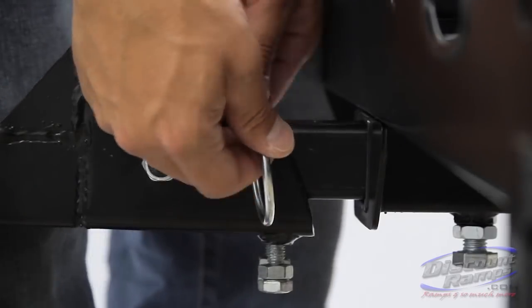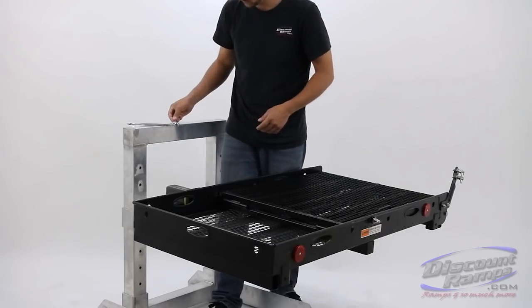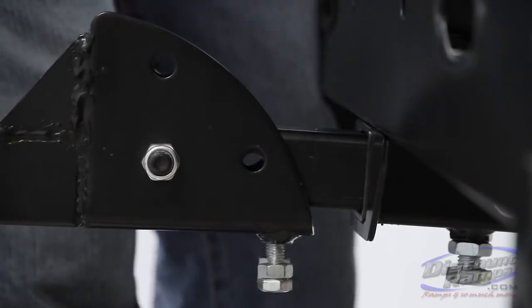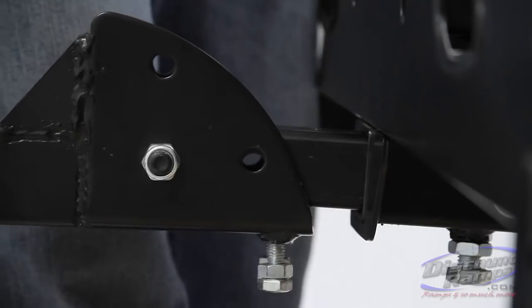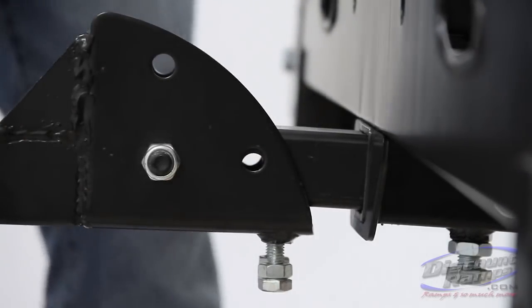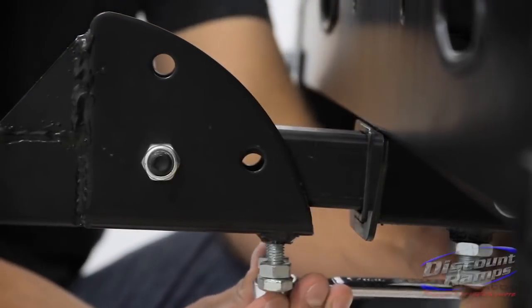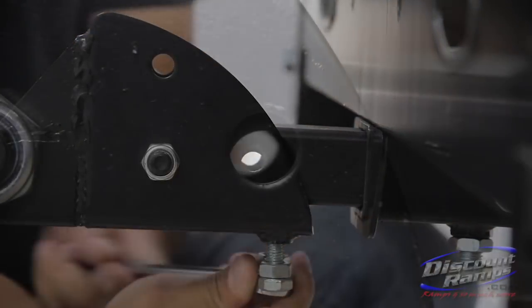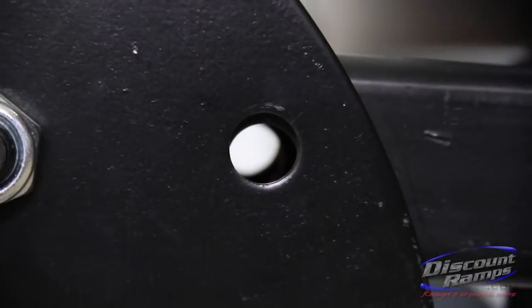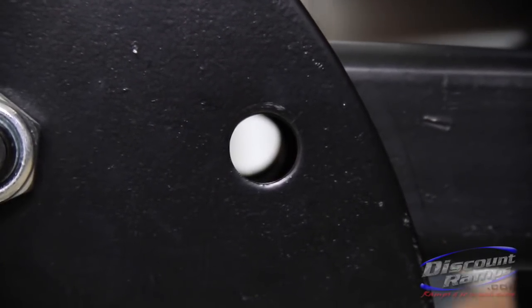The SC500 V3 can be folded upright to save space when not in use. To remove the pole pin, lift up on the front of the carrier and pull the pin out. The pole pin should be able to be removed or installed without binding if properly adjusted. To adjust the folding hitch tube, tighten or loosen the adjustment bolts. Once the pin holes are aligned, install the pole pin and fully tighten jam nuts.